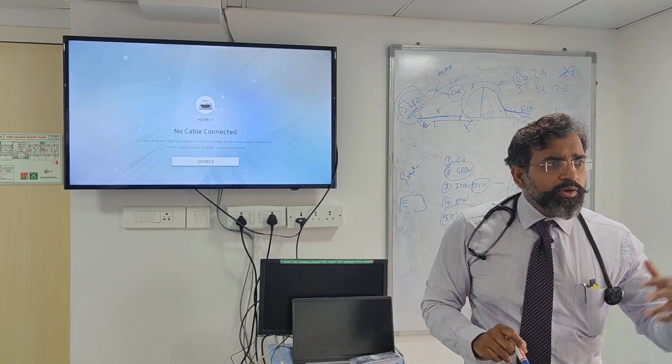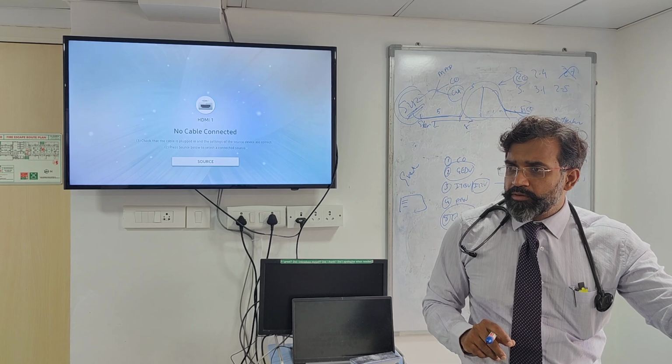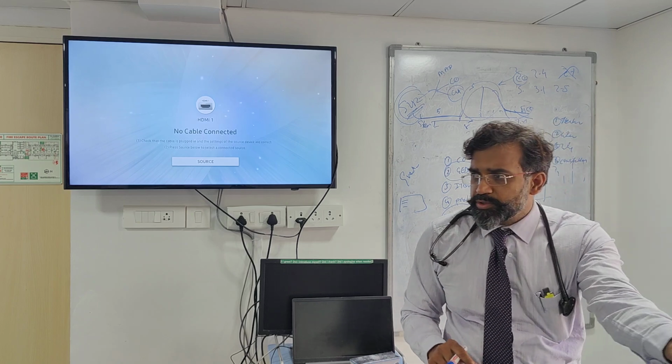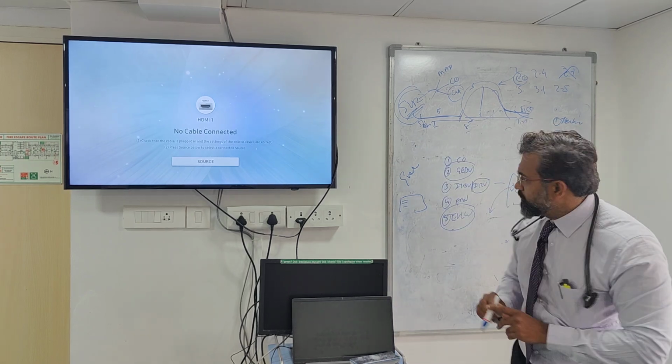Because you might look at noradrenaline and say SVR is very high, let me reduce my noradrenaline. Don't do it like that, because it's very essential that the central line is in place to say that the SVR is that particular value that you're seeing over there. Clear? Samajh mein aa raha hai?